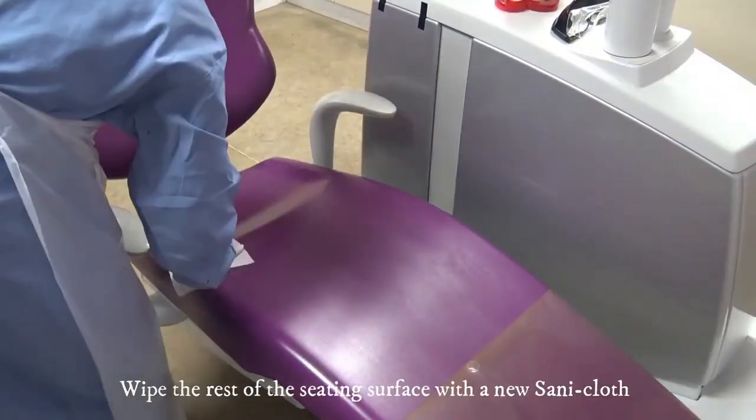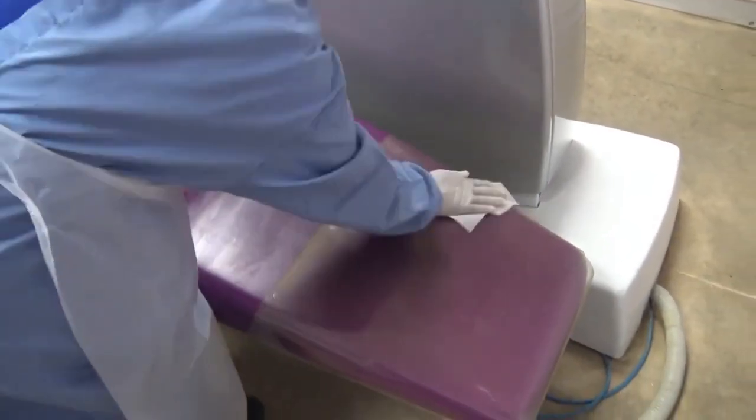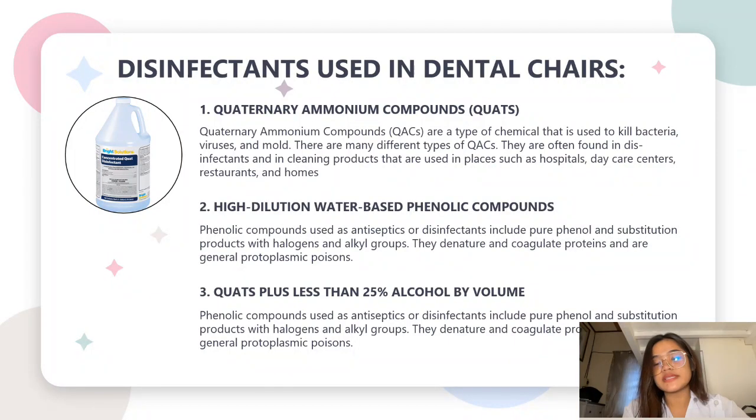Second, we have high dilution water-based phenolic compounds. So this refers to the disinfectants that are composed of phenol-based chemicals and are diluted in water to create a solution for various cleaning and disinfecting purposes. So the phenolic compounds are derived from phenol, which is a chemical compound with antiseptic and disinfectant properties. So the key points about high dilution water-based phenolic compounds include phenolic compounds, which include phenol and its derivatives. They are known for their antimicrobial properties. They act by disrupting the cell membranes of microorganisms, leading to their inactivation.